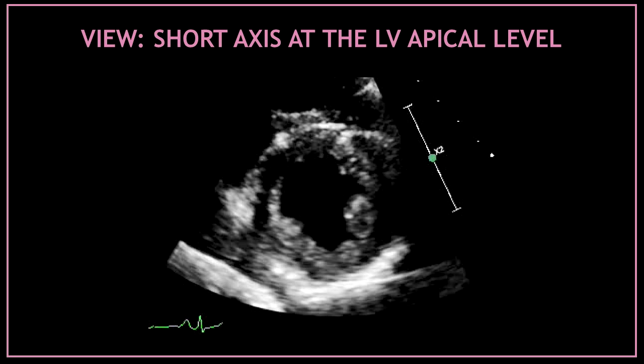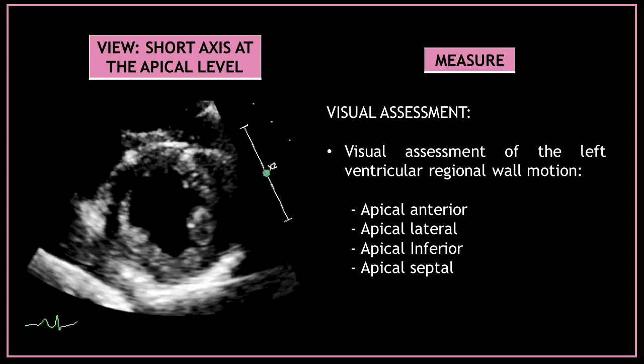There are different segments you can obtain from the parasternal short axis view. First I'm going to show you all the minimum data set you need to obtain from the parasternal short axis view at the left ventricular apical level. After obtaining this view, the first thing you have to do is a visual assessment of the left ventricular regional wall motion. At this level you can only see apical segments, so assess for any regional wall motion abnormalities of the apical anterior, apical lateral, apical inferior, and apical septal segments.